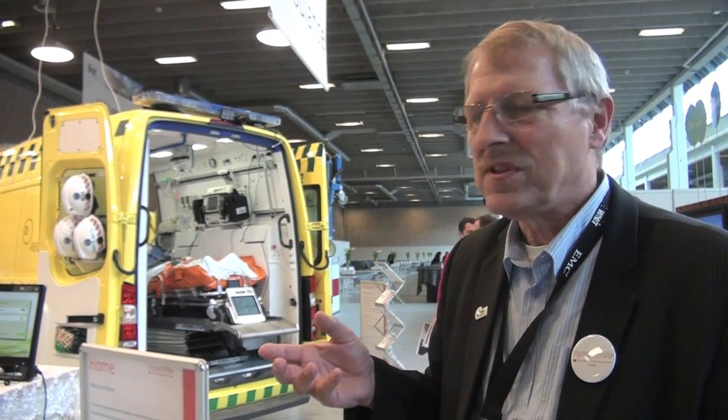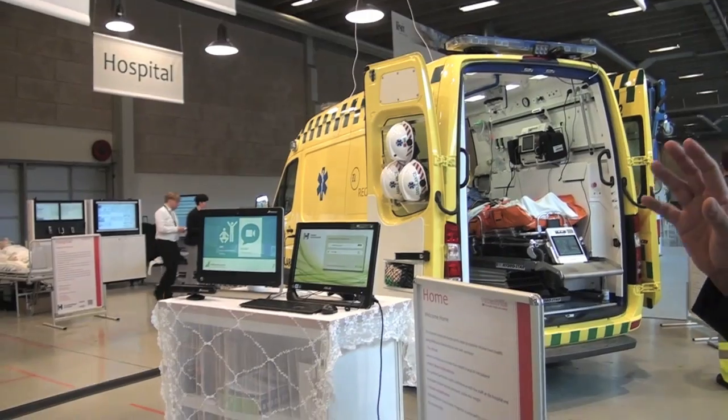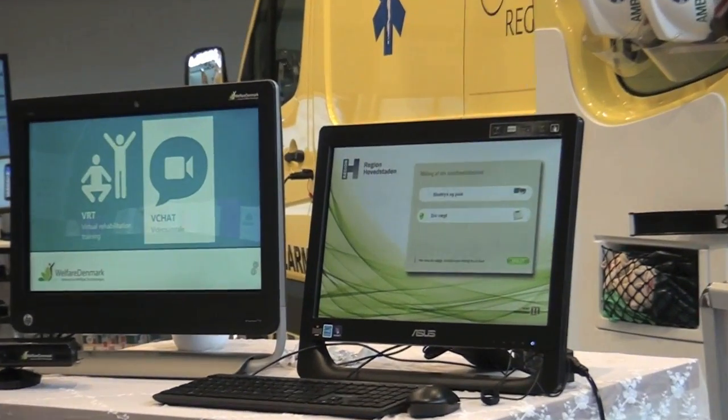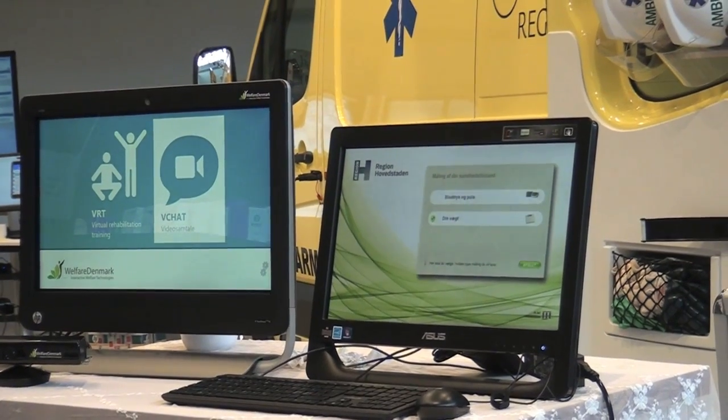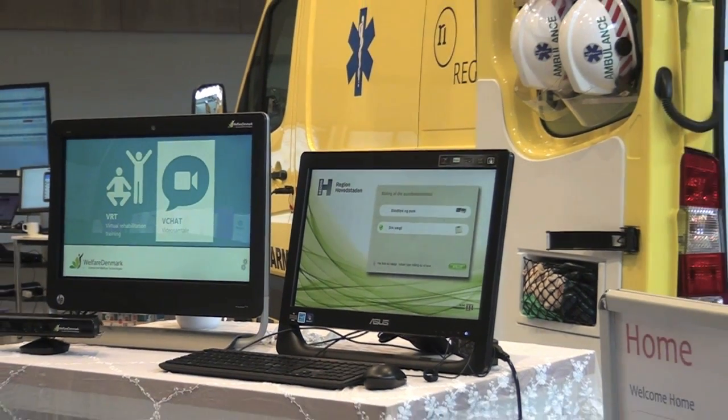Also at the pharmacy, the epSOS project is of course a project still. And what you've seen in the home, those systems that we show are still in the pilot phase, but some regions have already implemented as a routine home monitoring for COPD patients.